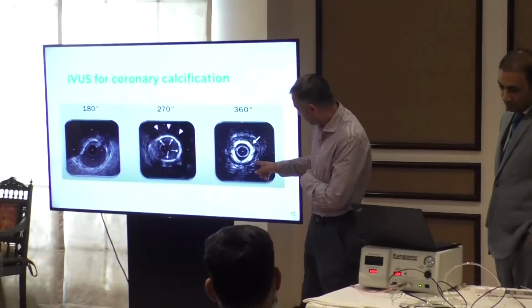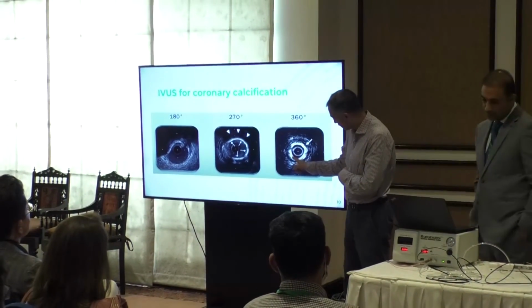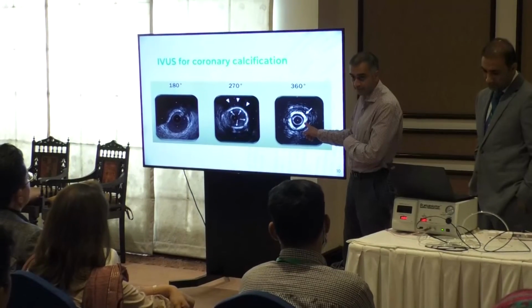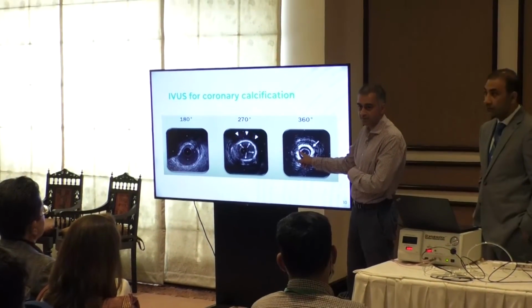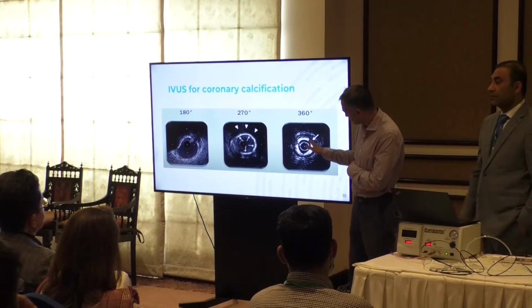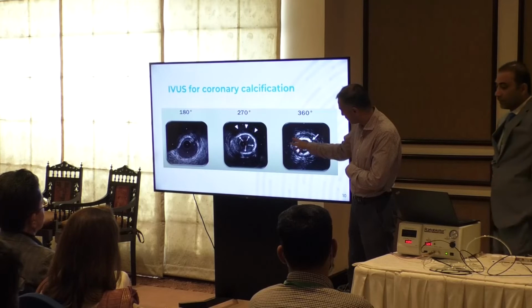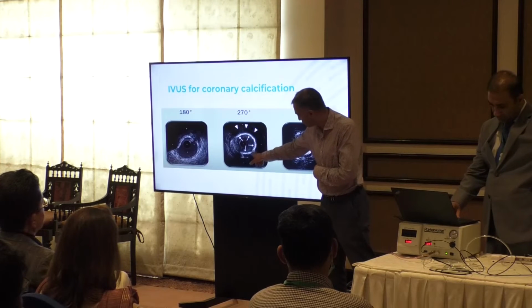Here you've got the IVUS probe, and this is calcium. Can you see that? This is what we call superficial calcium. Actually it does seem to have penetrated a little bit here, but on the whole, the IVUS won't penetrate through here.